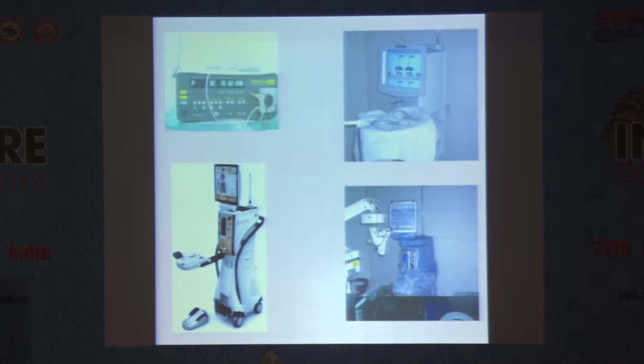When you are a very young surgeon, you have access to a very basic machine. This is my journey actually. I started with a very basic machine, but now I own Centurion. But the irony is that when you are learning, when you are a very novice surgeon, you have the very basic machine with a lot of deficiency in that. But everyone has to learn, and by modulating the machine, you can actually become an accomplished phaco surgeon even with the basic machines.